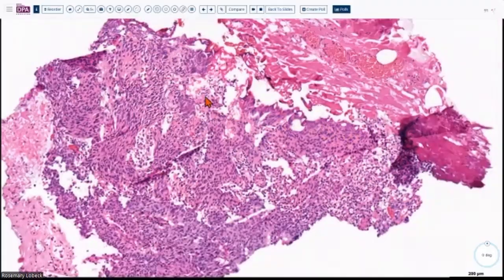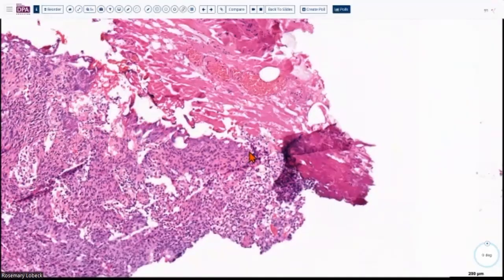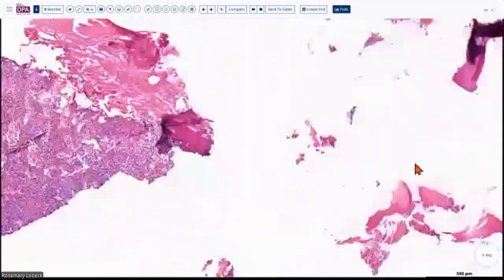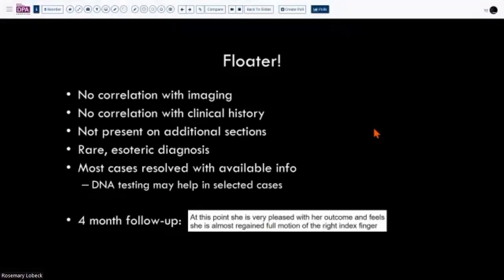This is cautery effect, right? So cautery effect in the soft tissue surrounding this, and I call up my orthopedic surgeons and ask them, when you do a bone curettage, do you ever use the cautery? And they're like, no, never. So then why is this piece of tissue having cautery effect and the osteomyelitis is just clean? Because this is a floater, right? So there's no correlation with the imaging here. There's no correlation with the clinical history, and the tissue was not present on any additional sections, and you make a rare esoteric diagnosis of intraosseous squamous cell carcinoma. That's just not going to happen, right?